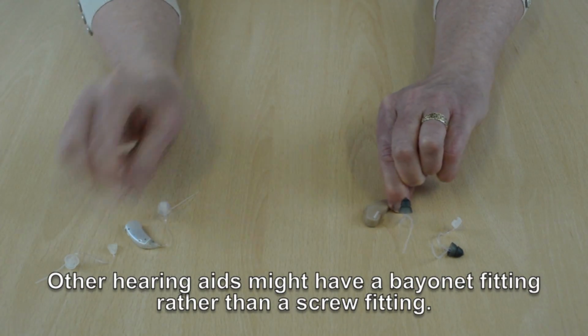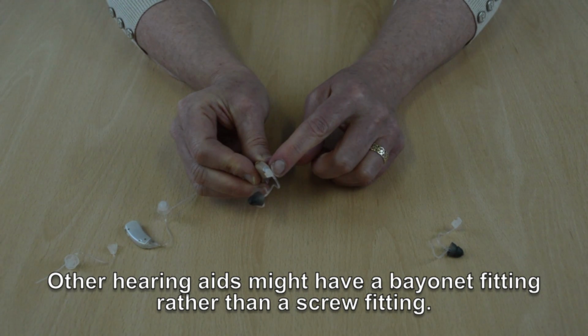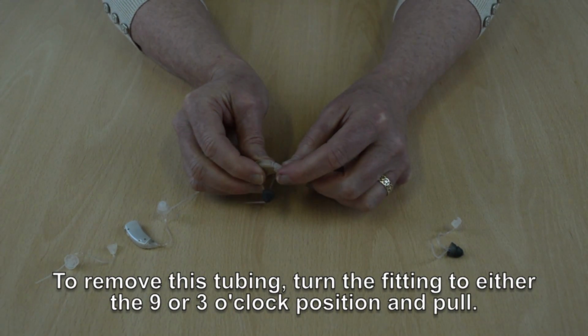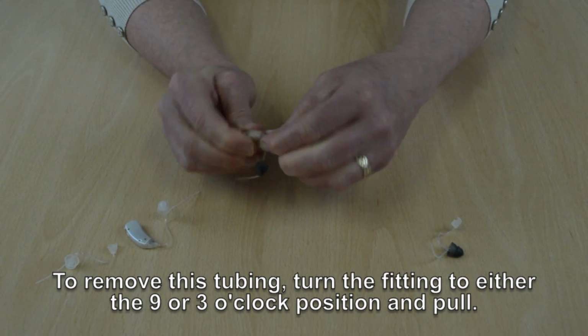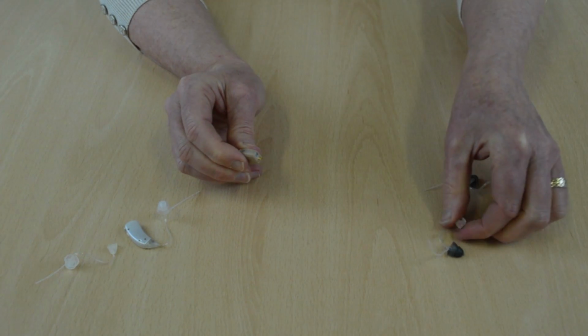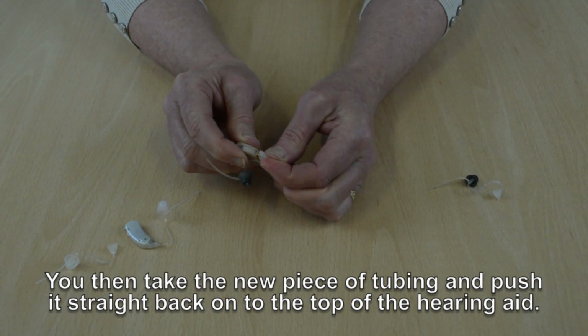For other hearing aids, the fitting on the top of the hearing aid is not a screw fitting but a bayonet fitting. So to remove the old tubing, what you need to do is to turn the hearing aid to either 9 o'clock or 3 o'clock and pull. Get the new piece of tubing and then push it straight back on to the top of the hearing aid.